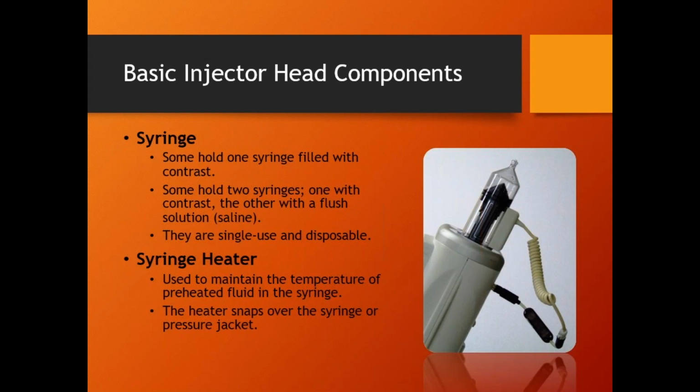Some versions of the Stellant, some software versions of the Stellant, have what's called a cardiac package, where it'll actually shoot both syringes at the same time. They can select, give me 60% contrast, 40% saline.